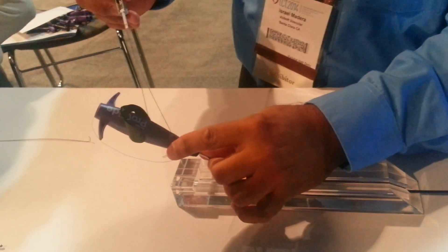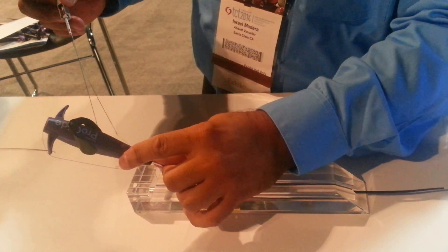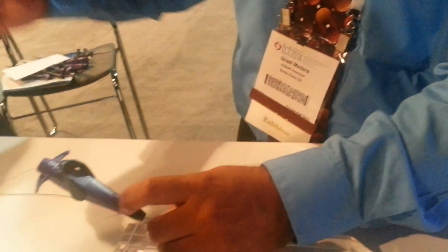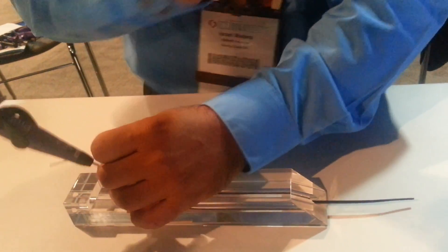I'm going to take this — keep going, keep going, keep going. Good, you got it, keep going — perfect. Now I want you to take this in like a violin — you're going to put it right here. It's called the quick cut. Use the metal, from the metal. And then the needles come off — pull, pull. Good, it will cut.